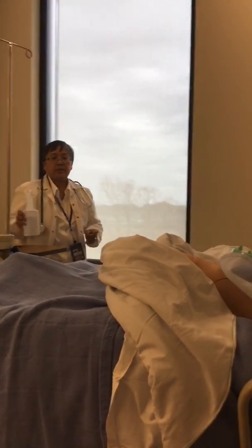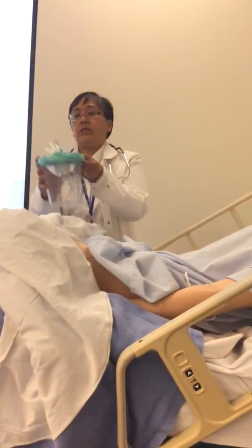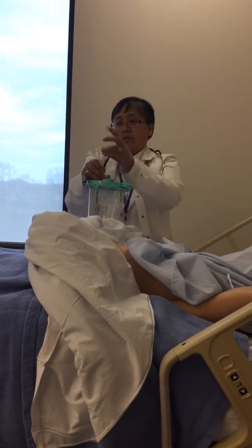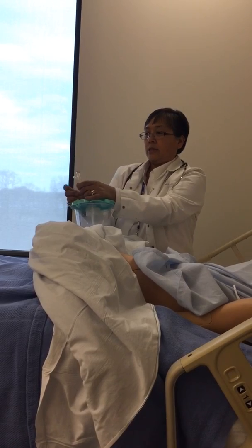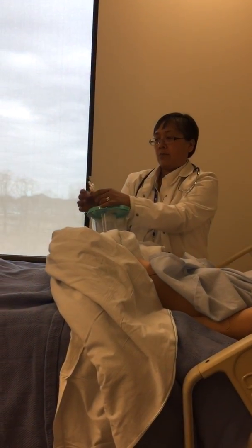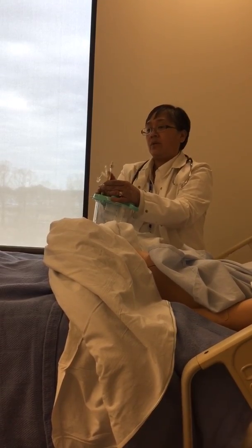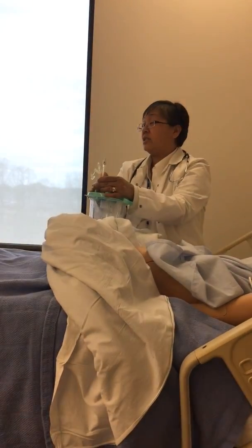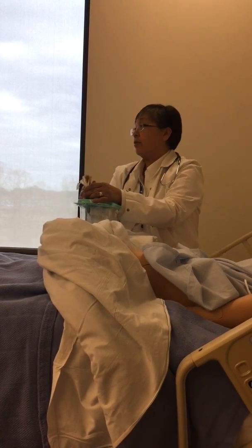And when you come to the patient's room, there's a few things that you want to make sure that you do. You'll see that this port has 3 prongs. So this one off to the side probably is more for medications administration. The middle one here is for continuous feedings. And then the last one here is kind of like an air vent.